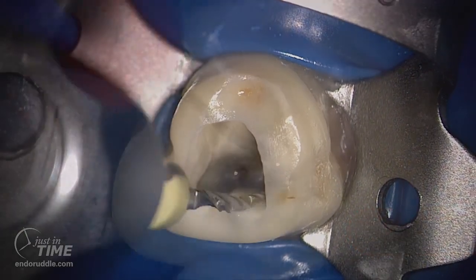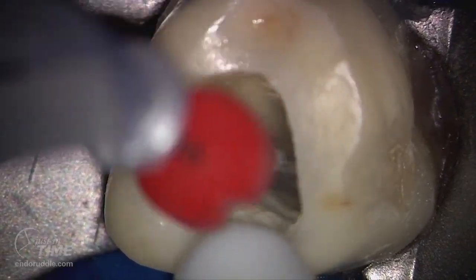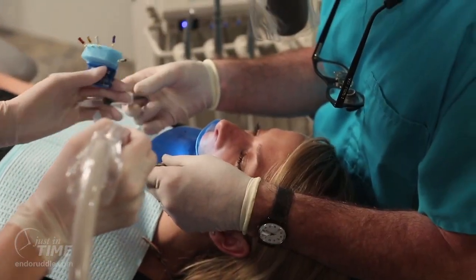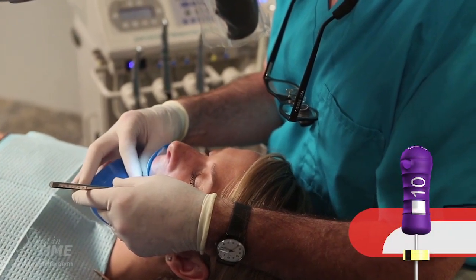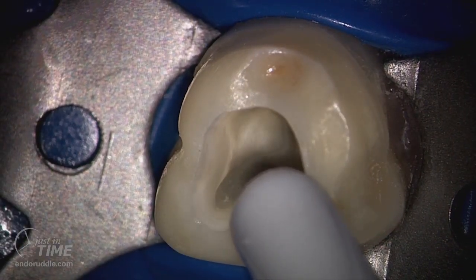Brushing allows us to create lateral space which promotes the instrument's inward movement. When we've achieved length, as usual, irrigate. Notice the massive amount of debris that has been produced from the X1 file. Irrigate to eliminate this gross debris. Then use the 10 file to break up radicular debris and move it into solution. Then re-irrigate to liberate this residual debris.